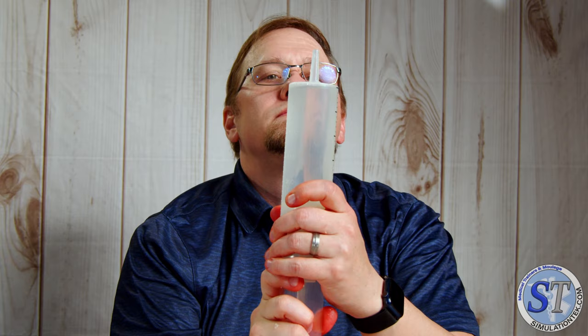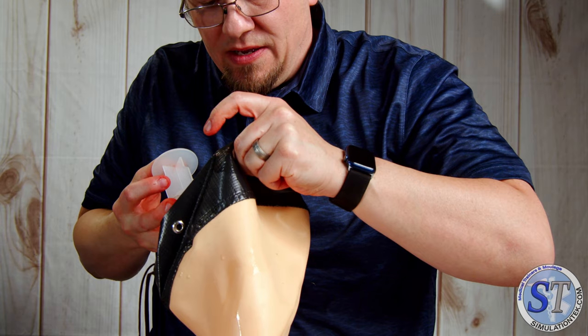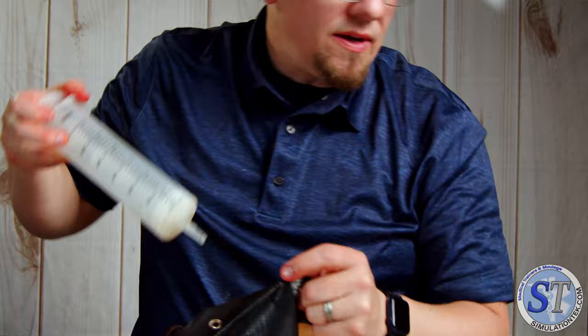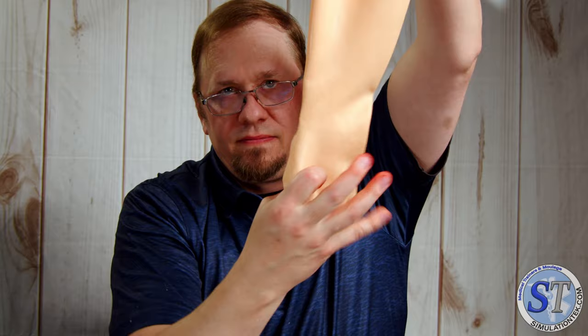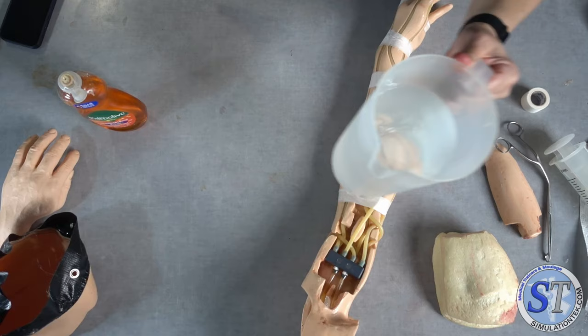So at this point, I'm just going to add some water down there. Now I could just pour it down there, but where's the fun in that? So I injected about 250 cc, and I want to get it all the way down there. Kind of soap it all up. Make sure everything's coated. And then what I'll do is I'll just dump some of the extra out.